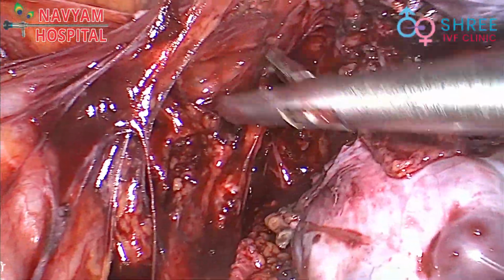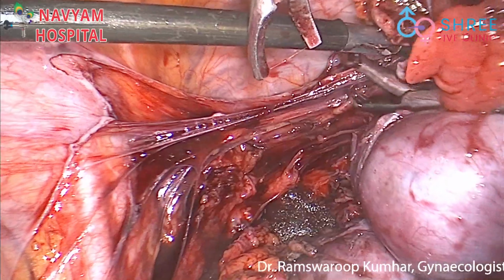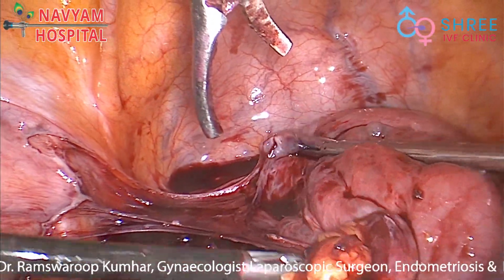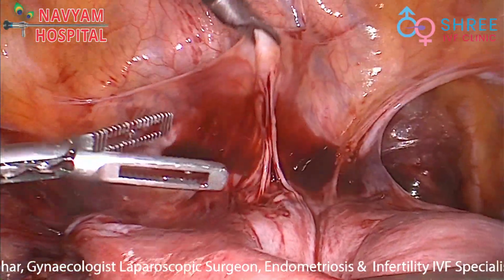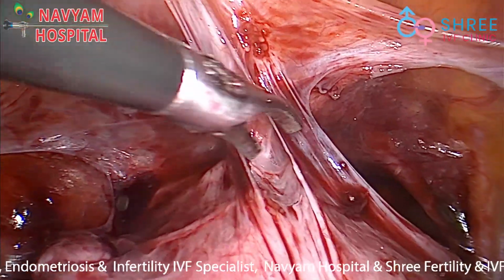The posterior dissection is almost complete, so we started to dissect the bladder. As this is a previous cesarean section case, the bladder is densely adherent at some places.